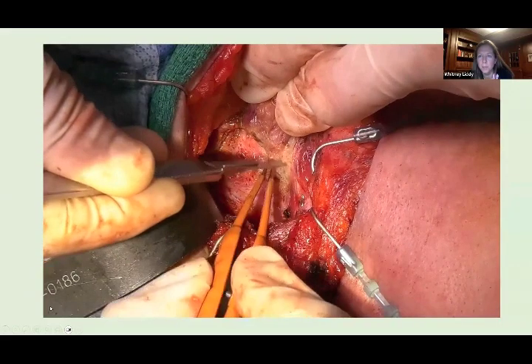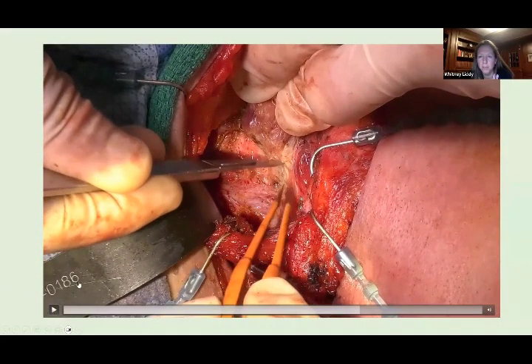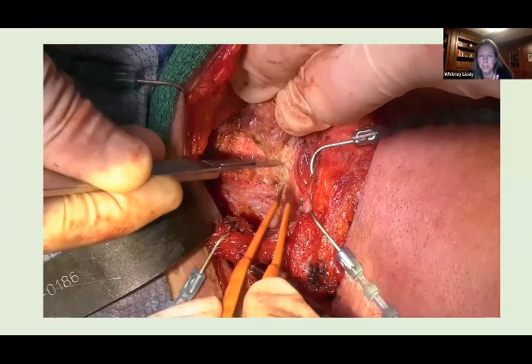Hey, Joe, you brought up a good point, and I just wanted to bring it up and see if anyone would do anything differently. You mentioned you really don't treat the nerve differently here, even though not only was the vocal cord paralyzed pre-op, but you weren't getting any EMG signal. But you still treated it. It sounds like you're treating it with care, hoping that you'll get something back. In some of the guidelines, even if it's paralyzed pre-op, if you get some sort of EMG signal, you try to preserve it. Is that generally your thinking in cases that aren't anaplastic?